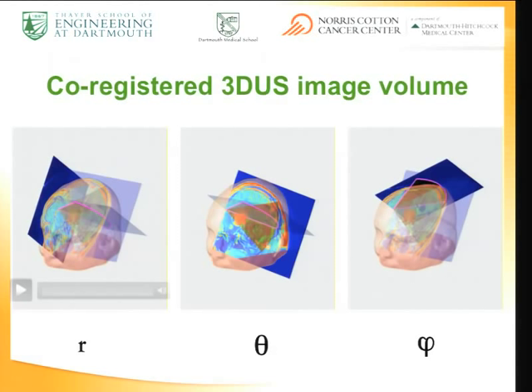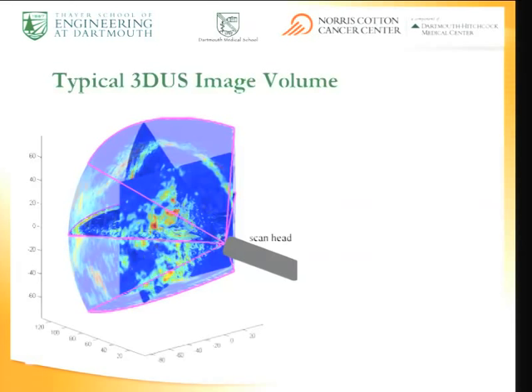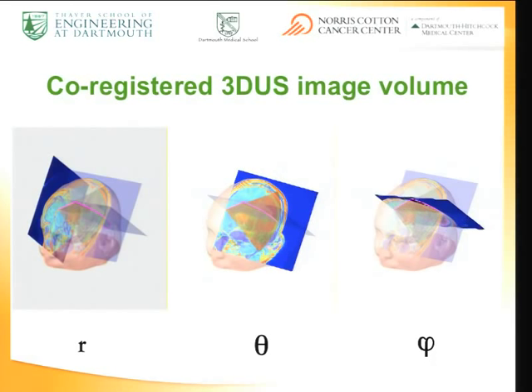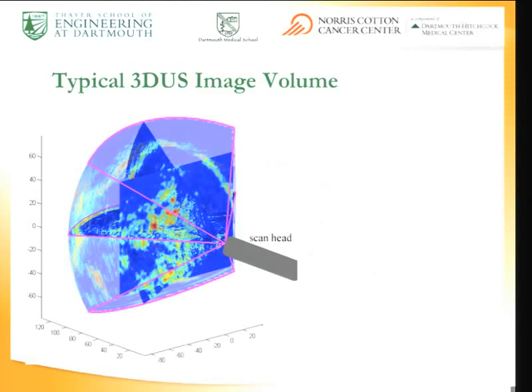Let me just show these. I think these will run here. So there's R moving. The scan head is up here. There's that point. So this is the plane orthogonal to the axial direction. Let me go back and see if I can get this going here. So this is the so-called theta angle, and then this is the phi angle, sweeping out this set of data. So the data comes in this framework. Here it is, just a set of orthogonal planes with our scan in here. That's great, except for what we wanted to use it for, there were definitely some limitations and things to work on. So the raw data was in this so-called frustum space.